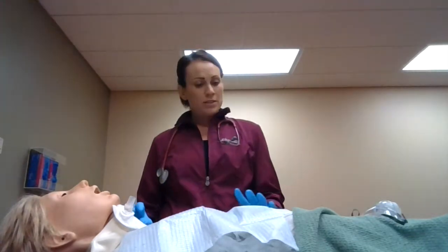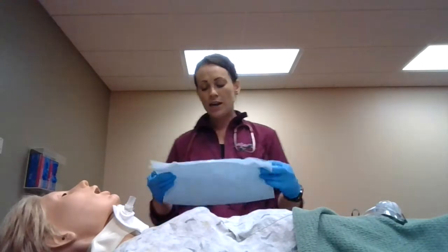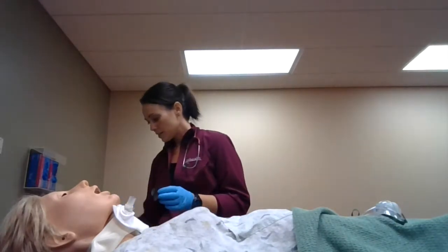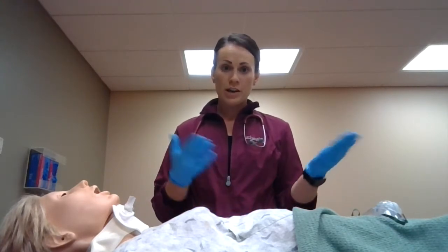The next thing we'll do is make sure that Mrs. Smith is nice and comfortable. We can go ahead and get rid of our supplies, set her upright, give her her call light, make sure she doesn't need anything, and we'll go ahead and let the nurse know that we did the trach care and document.